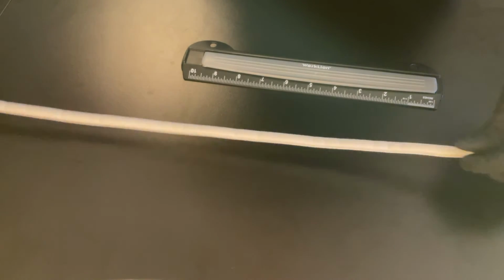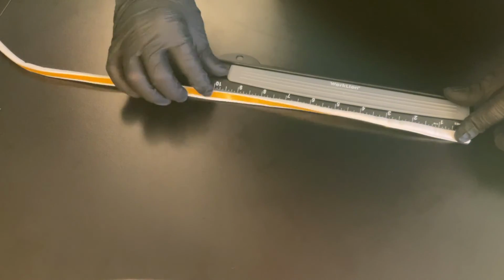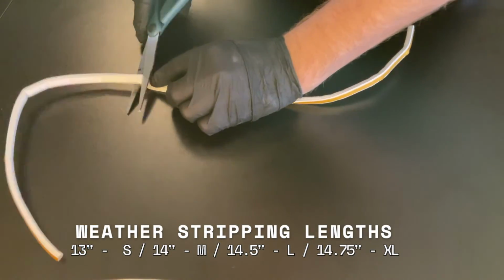Next, add the seal strip. Measure out the length of the strip you will need for the inner edge of the mask and cut. Remove the adhesive off of the seal strip.